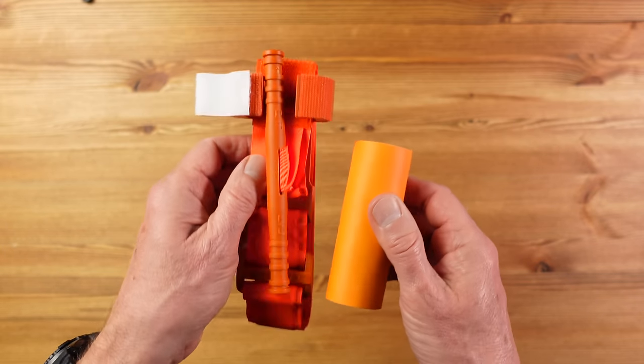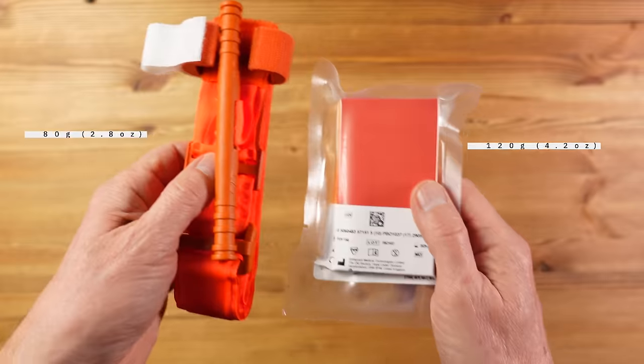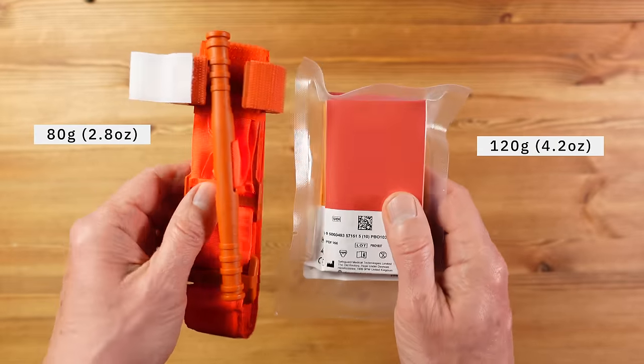In terms of drawbacks, it's not as quick or as easy to use as the CAT, and it's more difficult for self-application — say on an arm — although it can be done. Put the end in your teeth, do the first couple of wraps and then continue from there. It's actually 50% heavier than the CAT at around 120 grams. I'll come back shortly to which tourniquet I chose for my kit.